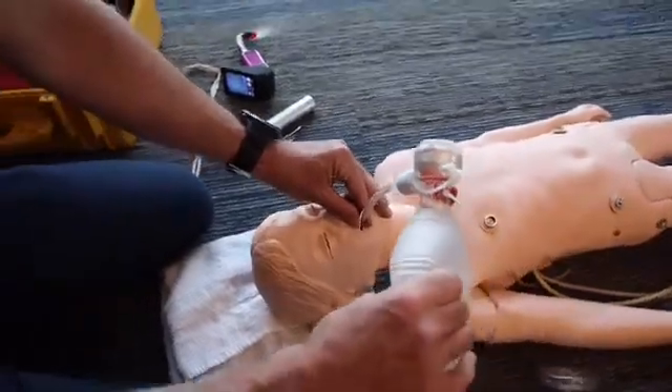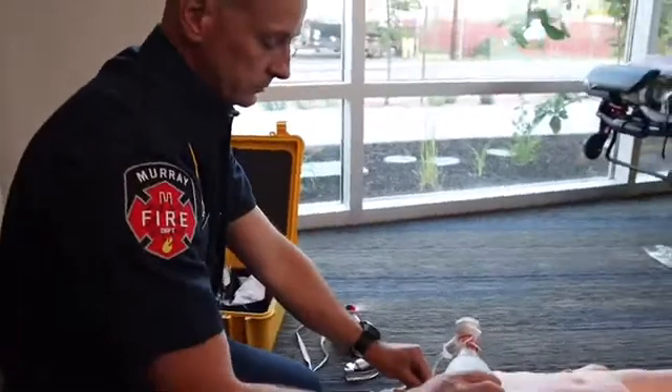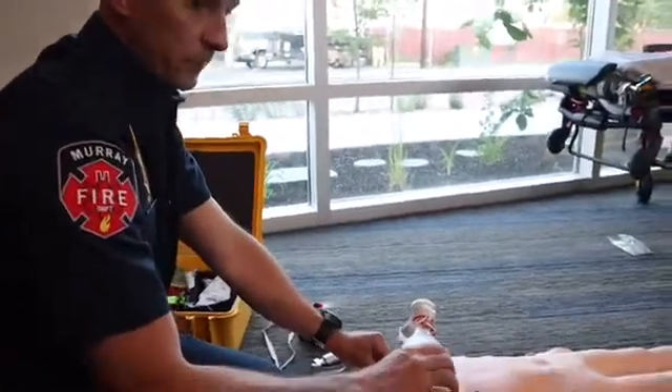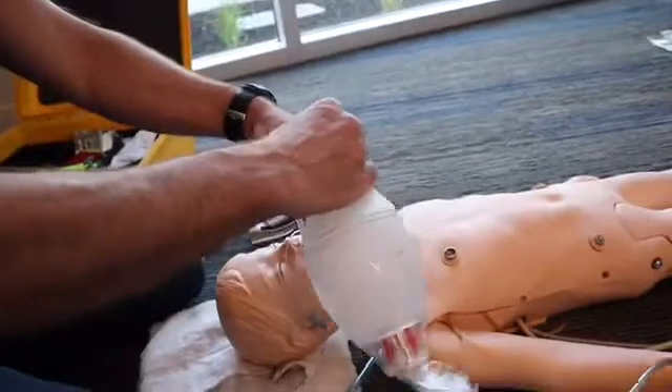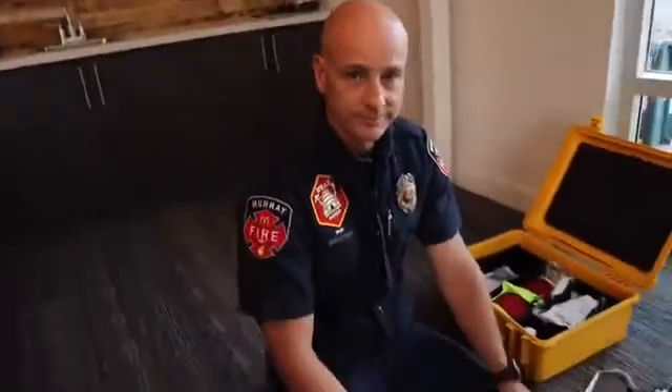Auscultate with a stethoscope for bilateral breath sounds, auscultate the epigastrum to note the absence of gastric sounds, look for misting in the tube, and also attach end-tidal capnography to look for adequate ventilations. Hopefully these tips and techniques will help us have an improved success rate with the AirTrack intubation device. Thank you.